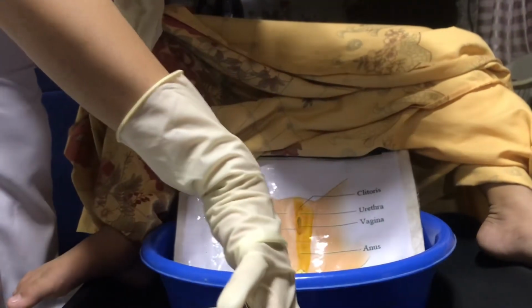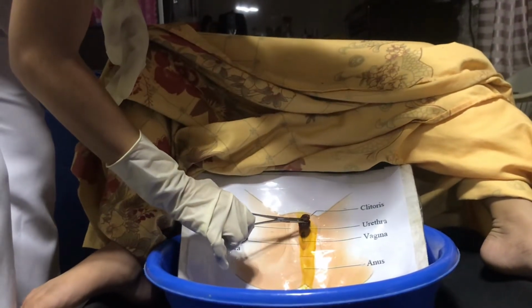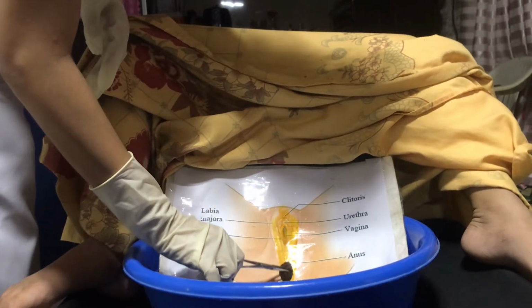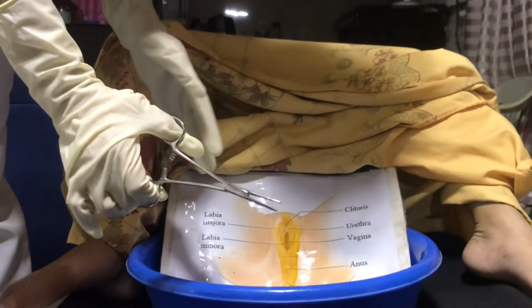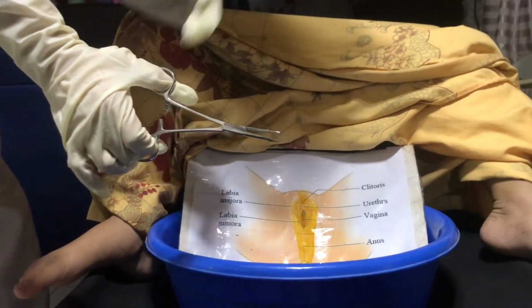Same goes with the third cotton ball, on the other side, figure of 7 down to the anus, then discard. The rationale is that secretions that tend to collect around the labia minora facilitate bacterial growth.